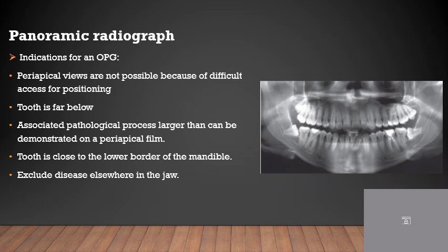So after the advent of OPG, the use of lateral skull and lateral oblique radiographs have come down. And the most commonly used radiographic view to appreciate multiple impacted teeth, be it maxillary or mandibular, can be seen in one X-ray, that is the orthopantomogram.